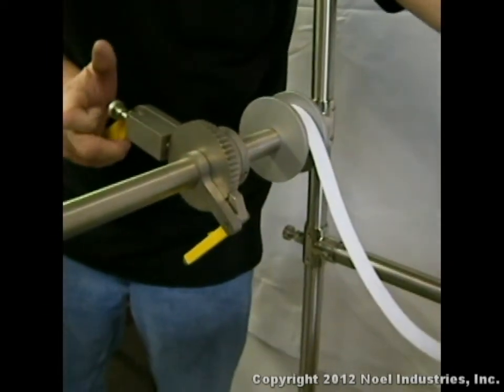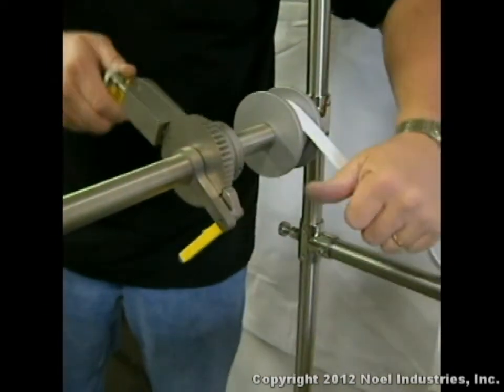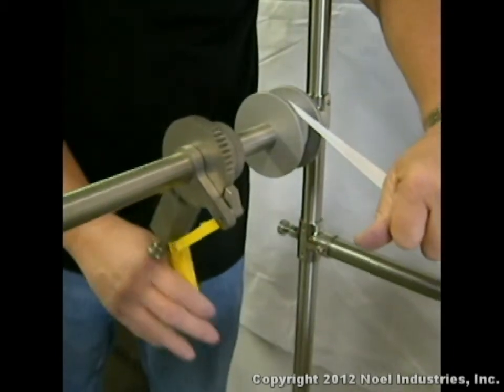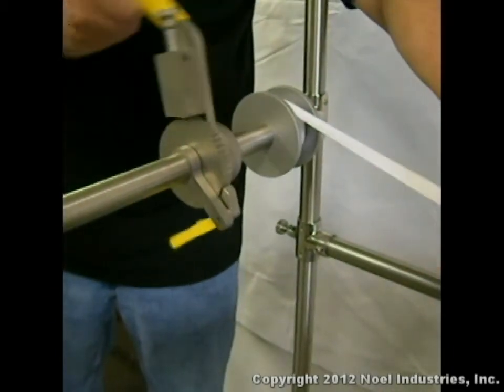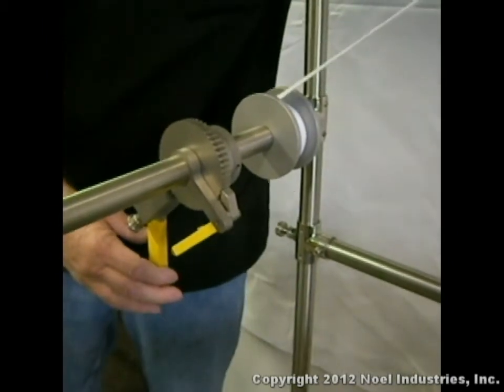To prepare the ratchets for the next procedure, rotate the ratchet knob clockwise 90 degrees. It will snap back into starting position. Then move the ratchet up and down to retract the strap.